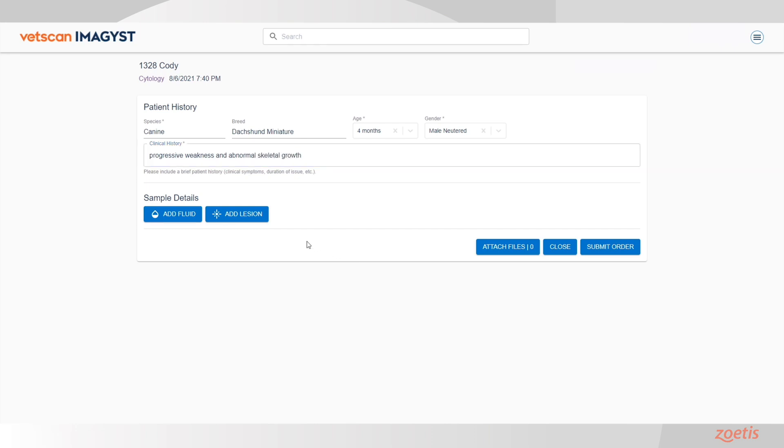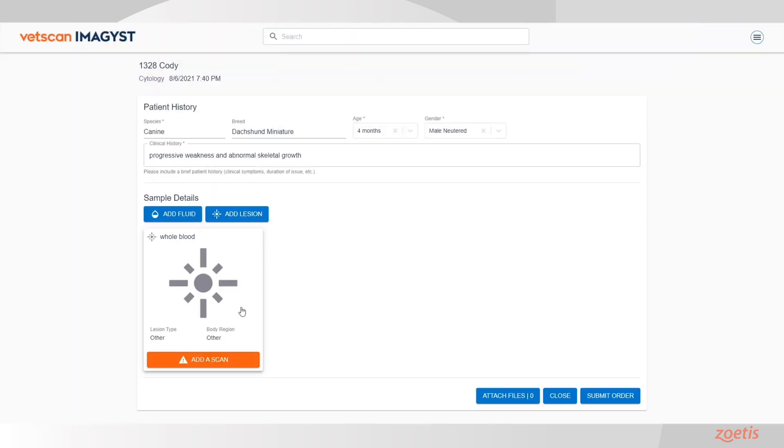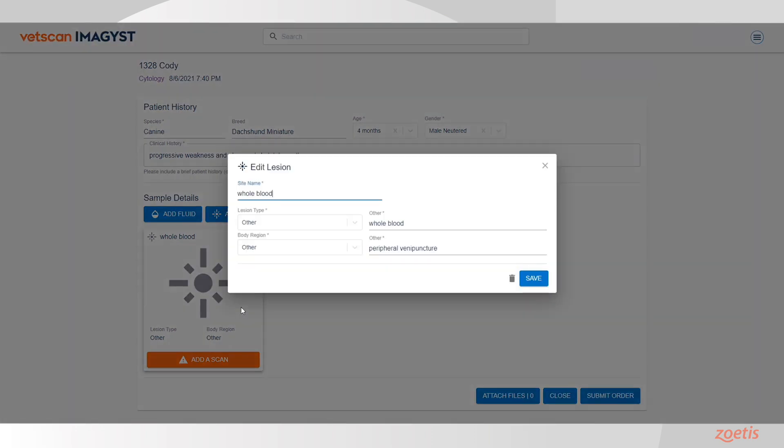Next, click on either Add Fluid or Add Lesion. Complete the required information and click on Create. You may create up to two different sites. Click on a sample card to open and edit a sample site.